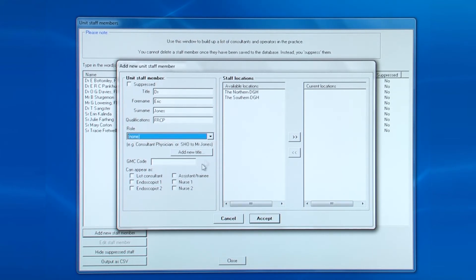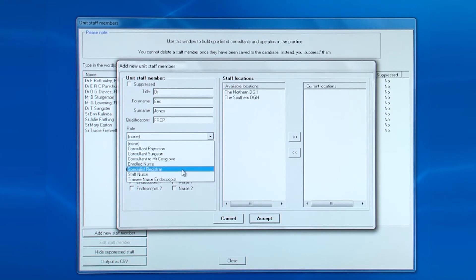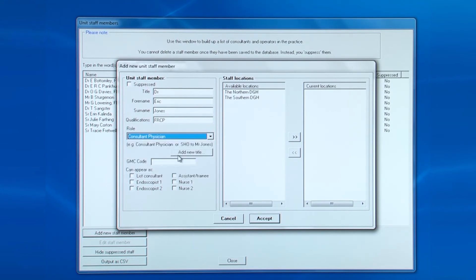If the person's role does not appear in the drop-down box, then click add new title. Then select whether they are endoscopists or nurses.